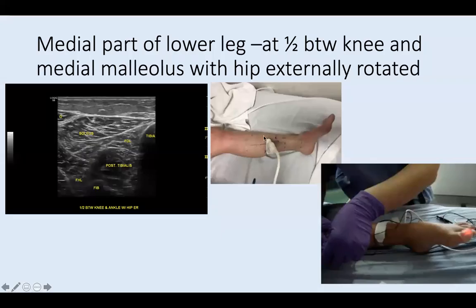And now I'm approaching the calf muscle from the medial part of the distal leg. So my probe is on the medial part of the leg. The proximal part is this one, with skin and the adipose tissue underneath. Distal is on the left side, right? So this is the gastroc, this is the soleus, this is the flexor digitorum longus, and underneath is going to be the posterior tibialis. You just imagine, this is the tibia here.